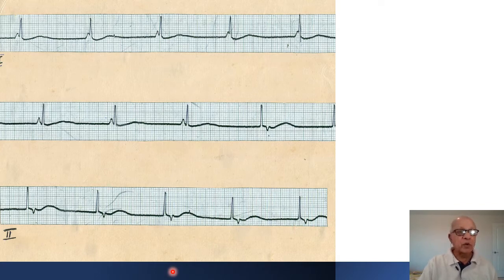Now you have facilities for implantable loop recorders which you can implant in the pectoral region here, and the impulses can be recorded using a recorder. They can be transmitted to the doctor's office if necessary, and this can be kept inside for up to 3 years. But that may not be required in this patient. A Holter monitoring is sufficient, and this would correlate the symptoms with the arrhythmia and show if there are long periods of pauses which may be causing the giddiness, syncope, etc.